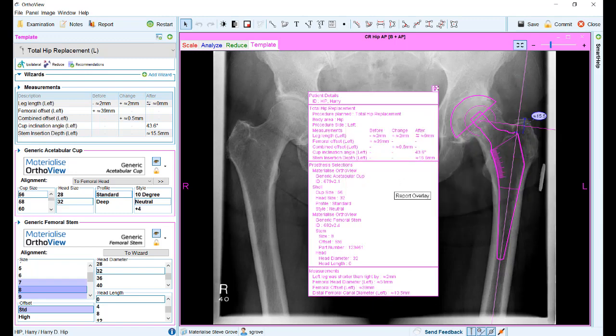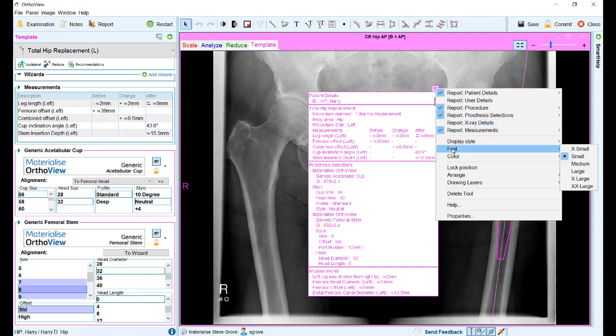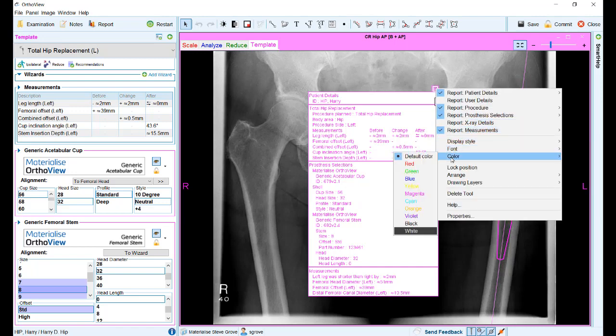As before, you can also adjust things such as display style, the size of the fonts, and the colours of the boxes.